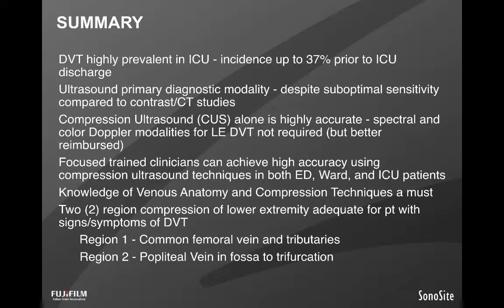And I'll tell you, with practice, you should feel quite comfortable and be able to readily either rule out the presence of or identify the existence of deep venous thrombosis in your patients. And I think it will really help in further testing and or management in various clinical situations.